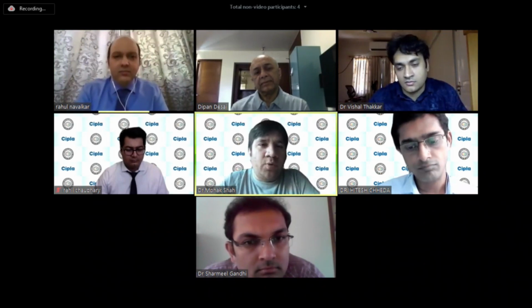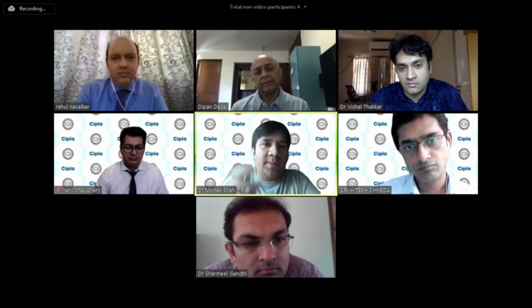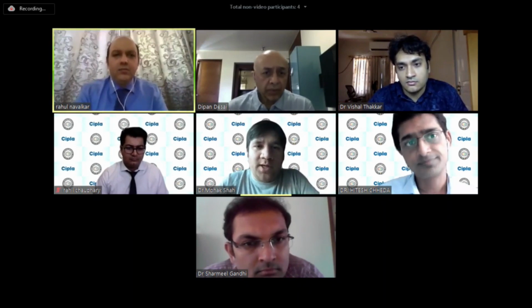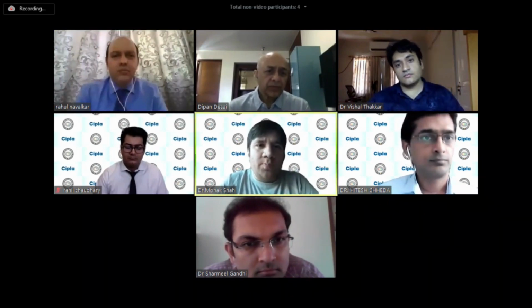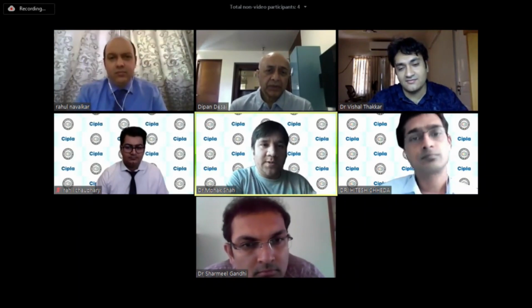Yeah, and regarding the post-RK patient, what you show in your case is absolutely correct. I also found the same result, that the auto-refraction is off but I don't know what is wrong. And when we take the vision, the patients are usually quite happy. Right. So the take-home point is, no matter how hard you try, your post-RK patients won't be that happy compared to post-LASIK or the post-PRK patient.